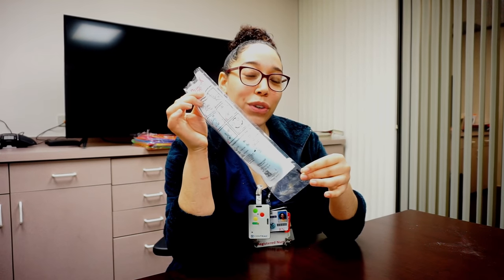Hey everyone! This is the video on how to use the Purewick external female catheter.